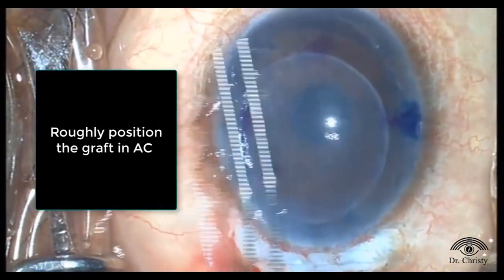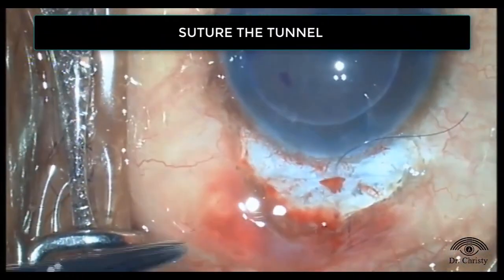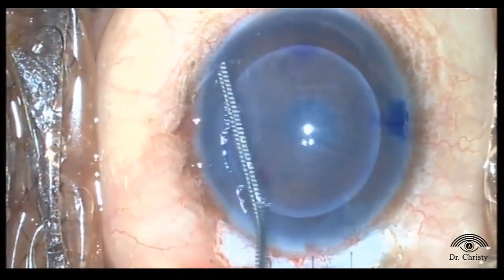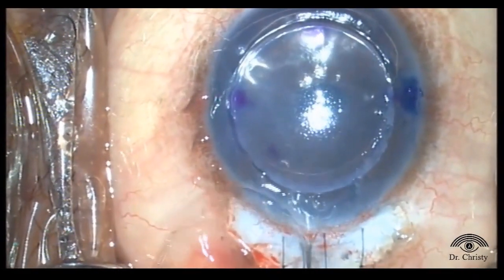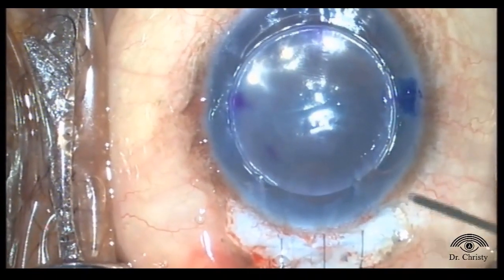And with the help of a specialized instrument, the donor lenticule is injected into the AC. There are several specialized instruments available for the same. The tunnel is sutured. The graft is positioned. Air bubble is injected to oppose it better. So that's 100% air bubble, right?